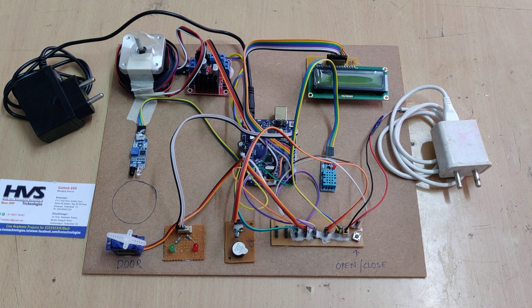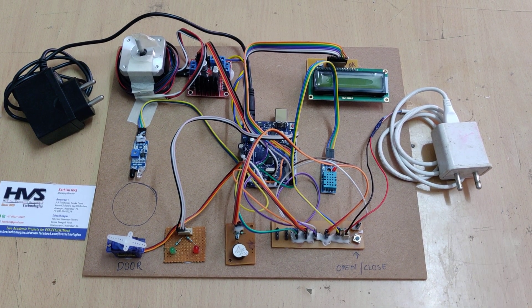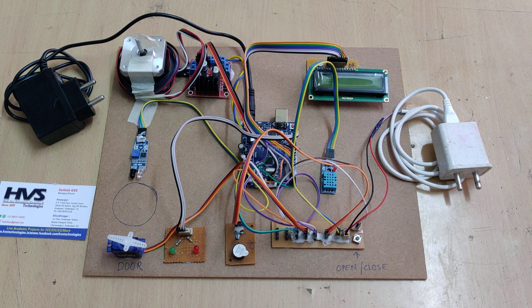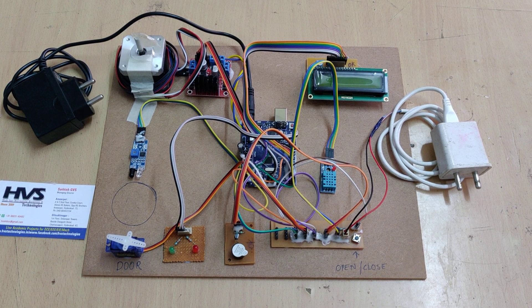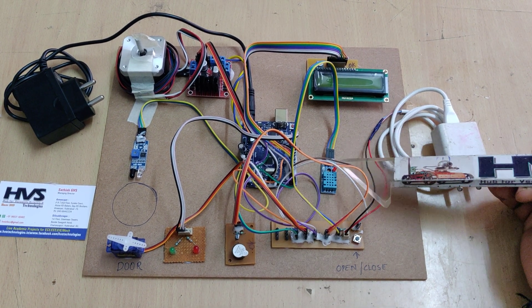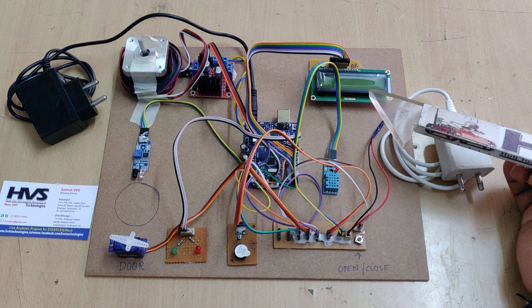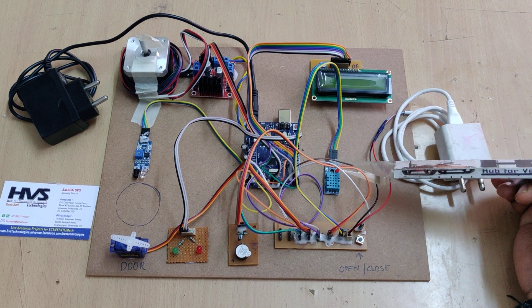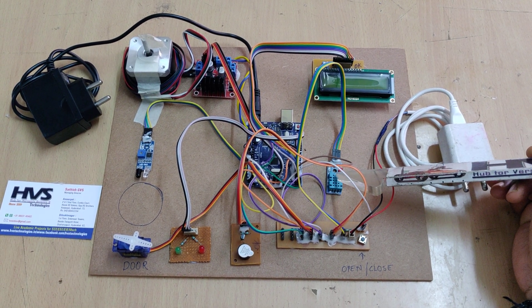Welcome to the project demonstration of automatic pill dispenser using Arduino and environmental parameters monitoring using DHT11. Here we are going to monitor the humidity and temperature from this DHT11 sensor.